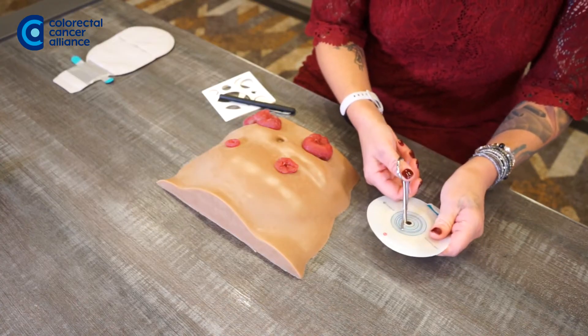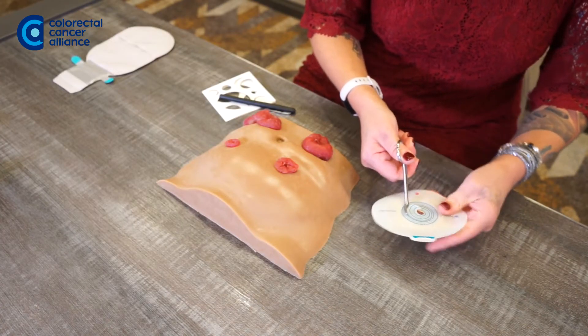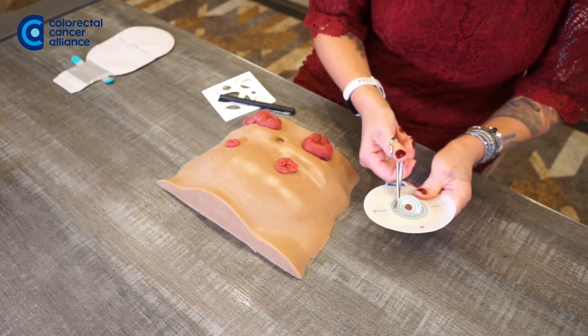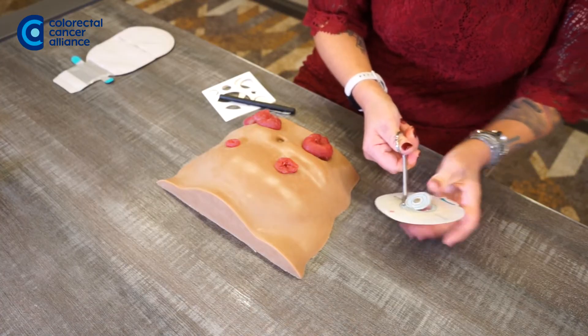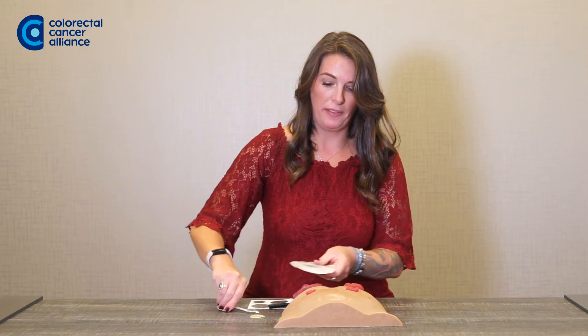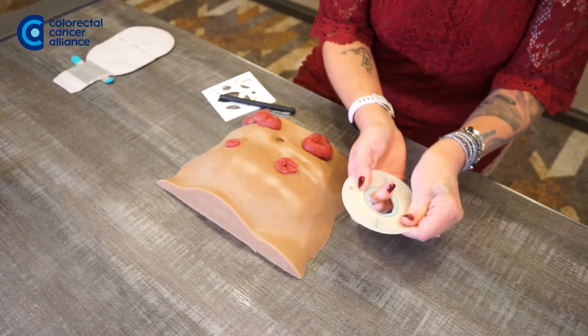Then once you've traced the circle, get your scissors and cut right along that line. I always like to also take my finger and just run it around a little bit to help smooth it if there are any rough edges.